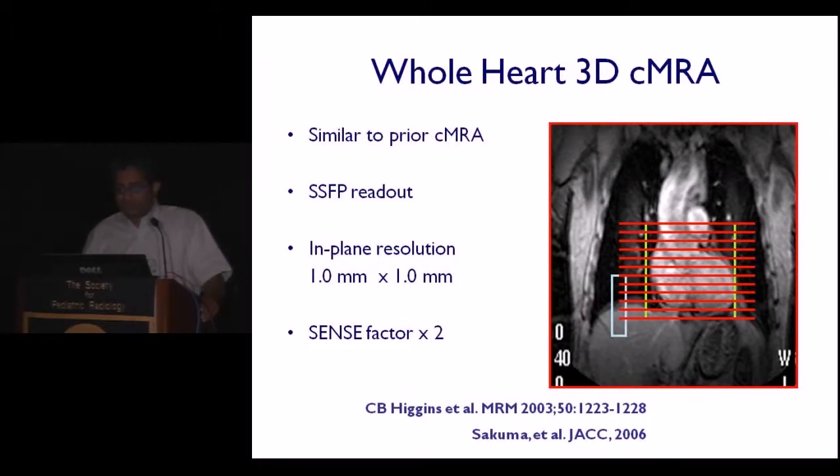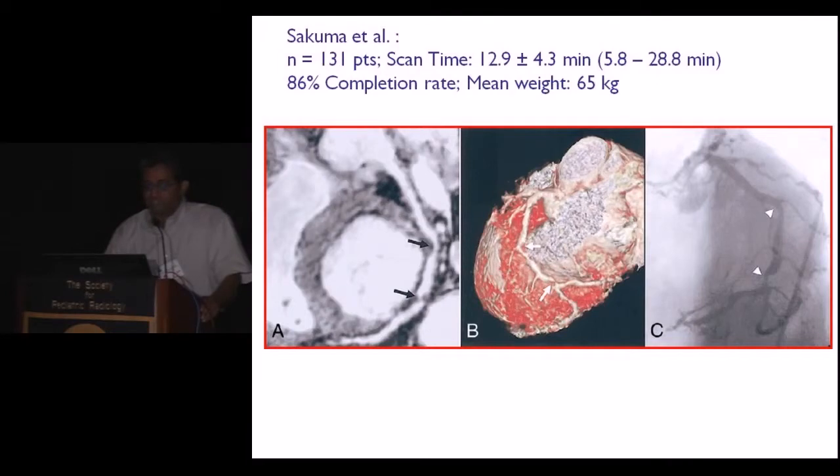Fortunately, the T2 of the arterial blood is much longer than the cardiac muscle or the venous blood. So by applying the so-called T2 preparation pulses, we could generate huge contrast between the two. So if you look at what is the delay time that I need to apply, here is a contrast difference. When I don't apply any T2 preparation, the contrast is minimal.